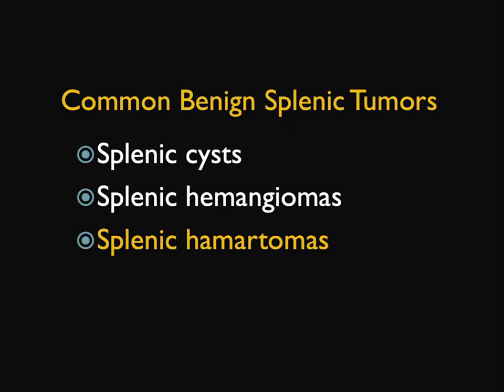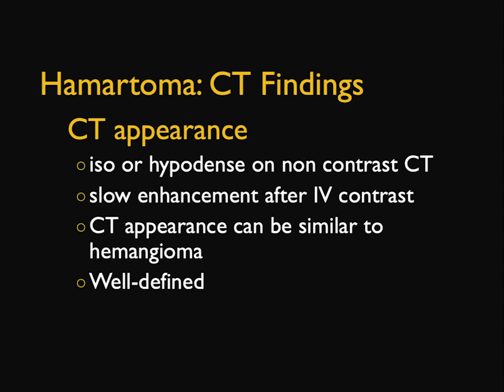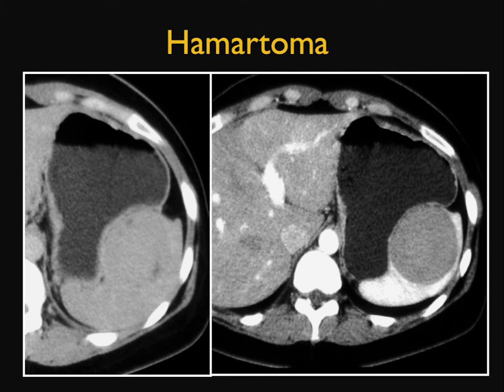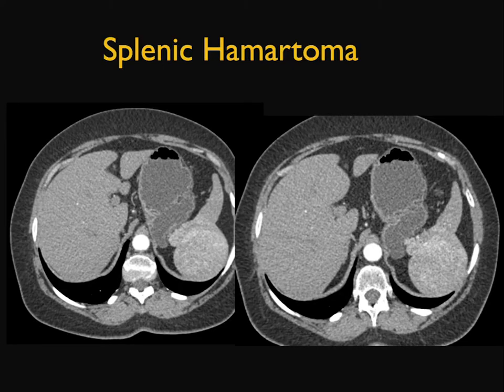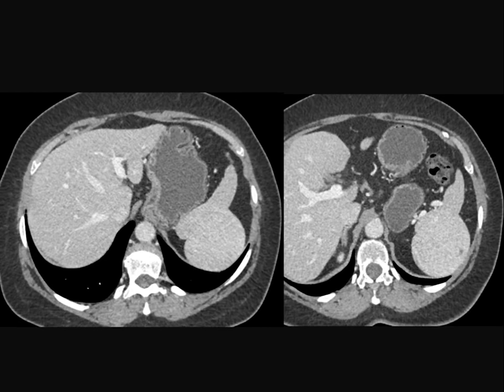Now, hamartomas — they're uncommon, an anomalous mixture of splenic elements. They're usually solitary and more common in tuberous sclerosis. The CT appearance is hypodense or isodense on non-contrast, with enhancement with contrast, and very well-defined — in fact, better defined than hemangiomas. The other thing about them is they tend to protrude beyond the spleen. You can see how the lesion kind of bulges out with well-defined sharp margination. The enhancement is fairly homogeneous, vessels are stretched, then it washes out — a very exophytic appearance. Hemangiomas are always internal; this exophytic appearance is really suggestive of a hamartoma.